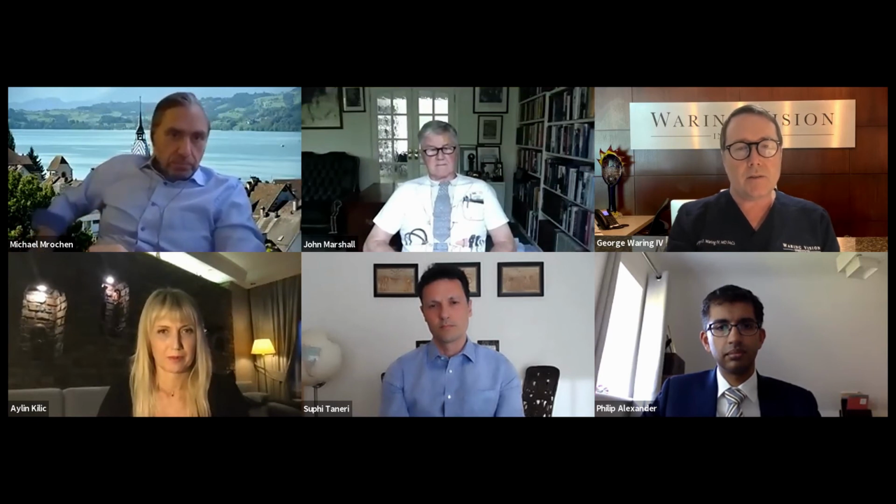So what we started doing, John, in our clinic, was combining extended depth of focus in the dominant eye with trifocality in the non-dominant eye. So we got as many click stops as possible, plus that additional near reading benefit, and then we covered the in-between with an EDOF. That was just a personal concept that always made sense to me. First we had EDOF, got our experience with that, and realized we weren't hitting the mark for reading. Then we got trifocality much later than you all did, but realized that it was unforgiving in most eyes and had its shortcomings, as you mentioned.